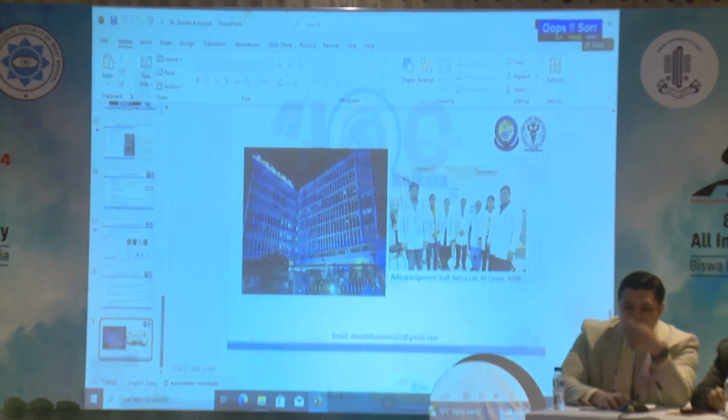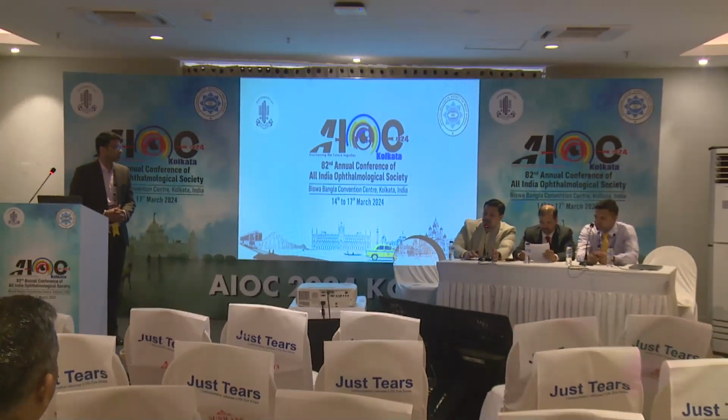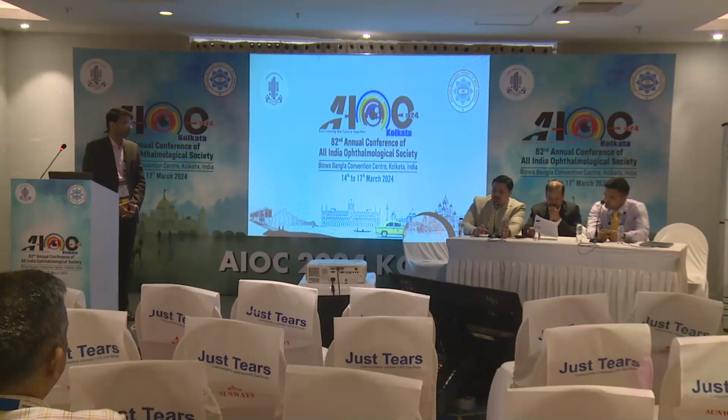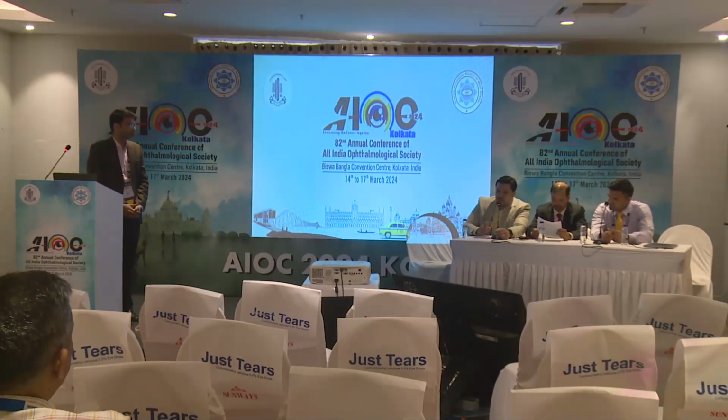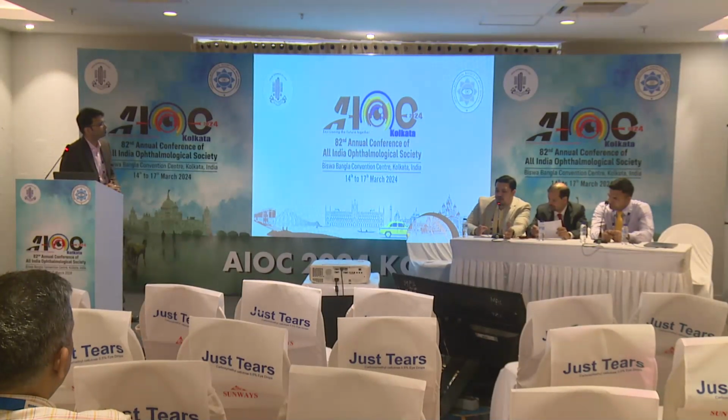Thank you, Dr. Devesh. I would like to thank you that you have summarized all the basics of OCT angiography very crisply. Just one question that I wanted to ask you. Being in RP Center, you have availability of swept source OCT angio as well as spectral domain OCT angio. So for a beginner retina specialist, what do you think should be the ideal way?